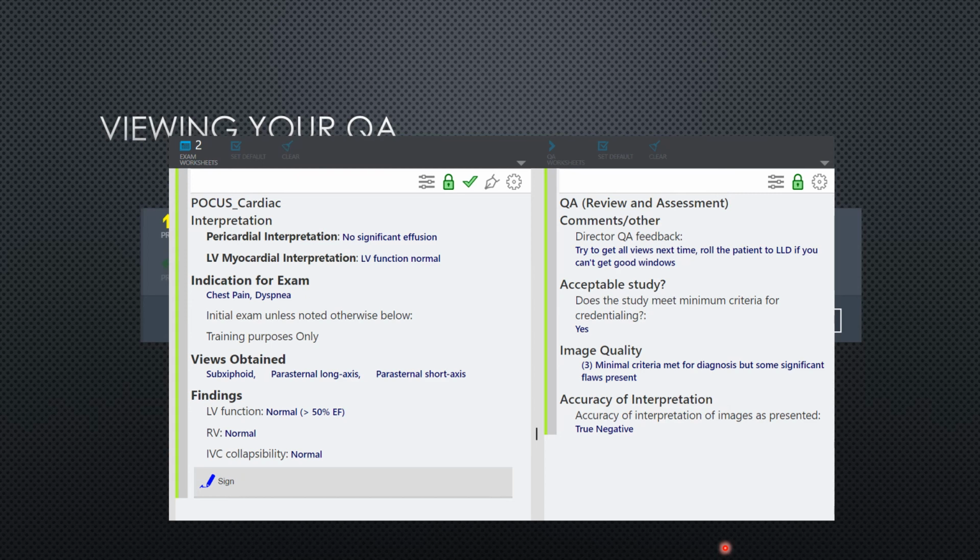And then you have your image quality here. And this is graded 1 through 5. And you want at least a 3 because anything a 3 and above is overwhelmingly getting credit unless there's some other major issue. Like even if your images were great but you didn't have an aorta measurement, I can't give you credit for it, right? So barring something like that, usually at least a 3 gets you credit. A 1 basically says I can't recognize anything on the screen.